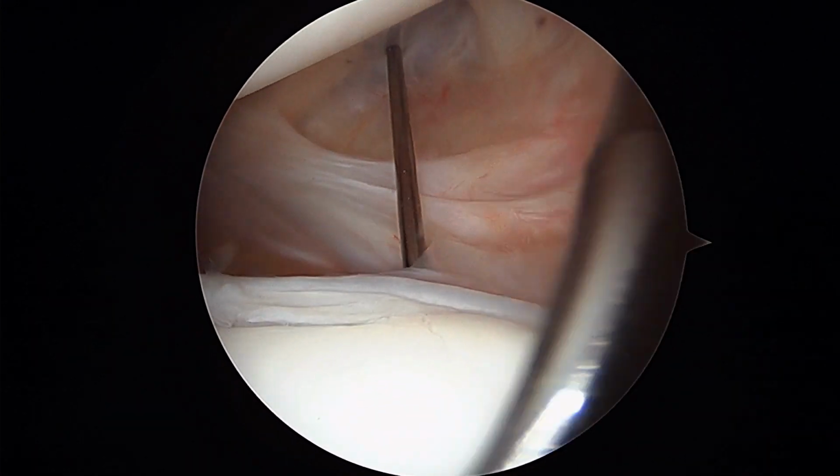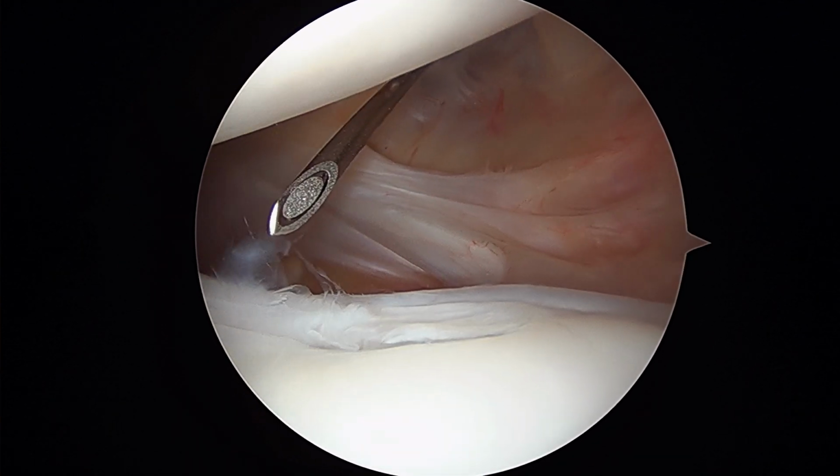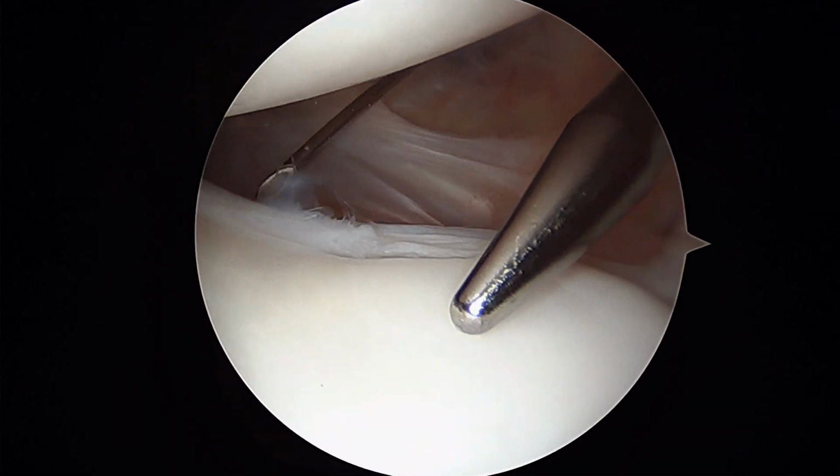We're just getting started on the left shoulder. We confirmed that your shoulder would dislocate actually quite easily, not only in the anterior direction, but also in the posterior direction. And this is our first look inside the shoulder.